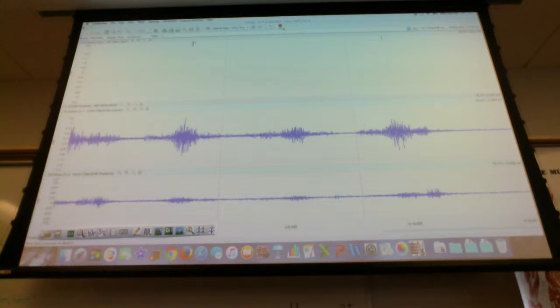If we're talking about measuring electromyograms, we're talking about measuring what's going on in muscle. What unit do we use to measure what's going on in a neuron or muscle fiber? It's voltage. They're small, so it's millivolts. And in fact, they're going to be smaller than when you talk about the action potential. What is the top of the action potential? You have depolarization. How positive does that cell get? It's plus 30 millivolts. Now, what we're measuring is smaller than that because we're measuring it at a distance. We're not directly inside the muscle, right next to the muscle fiber. We're looking at it from a distance, so we won't get 30 millivolts.